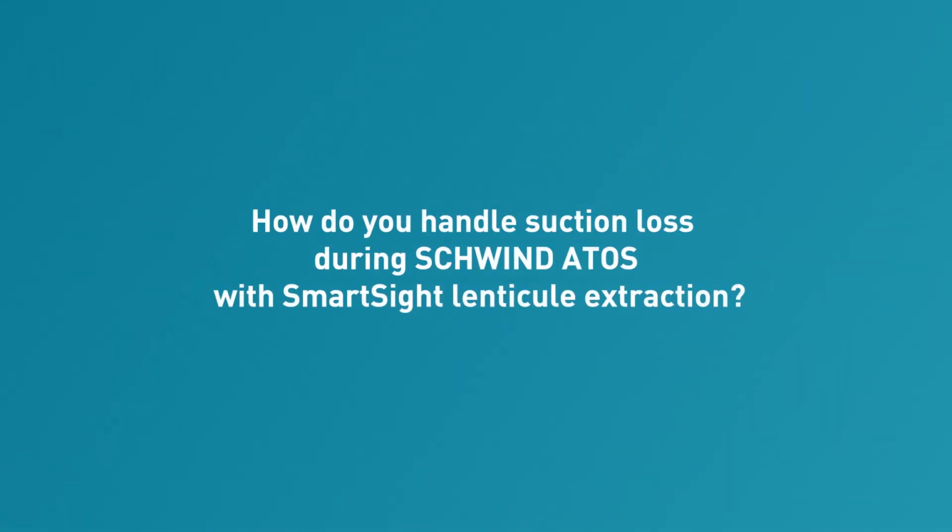I think I would start first of all with LASIK and be comfortable with docking with LASIK, maybe get at least 20 to 50 eyes of LASIK done, comfortably done, before you move to SmartSight. Because with LASIK, if you don't center the eye perfectly, it doesn't matter as much. With SmartSight, that will translate into a change in their vision. So it's, in theory, less forgiving with SmartSight than it is with LASIK. You can reapply suction if you lose suction early in the laser pattern or the process. But if it's happened late in the process, then I normally will just convert to LASIK.